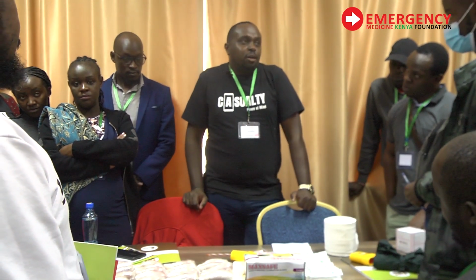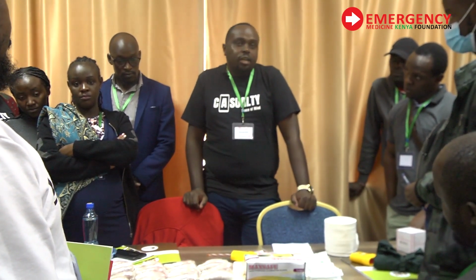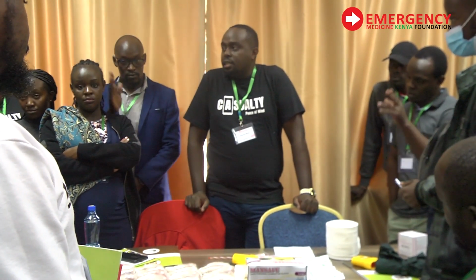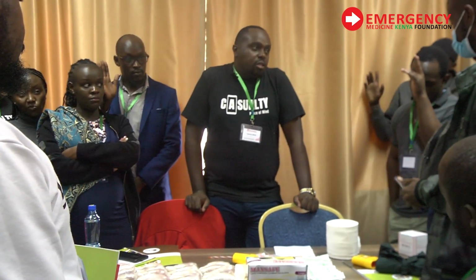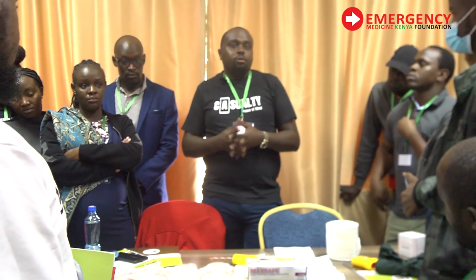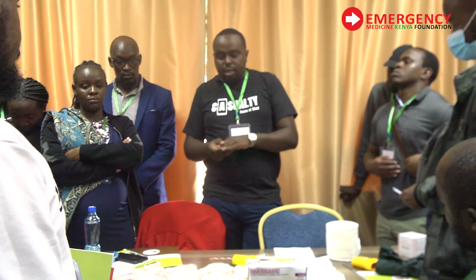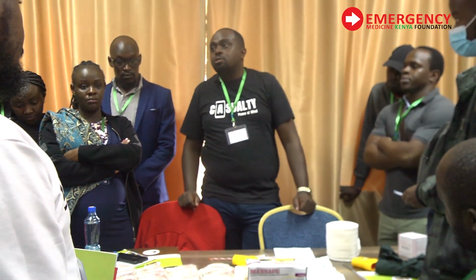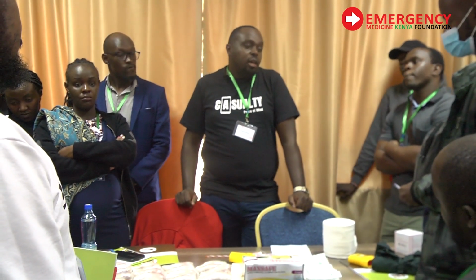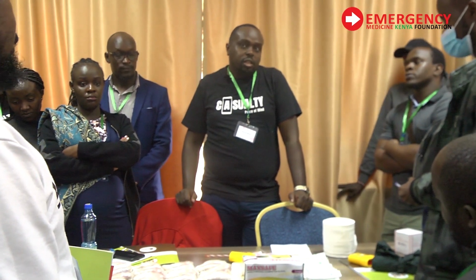So maybe I'll start with a question. How many of us have ever done an intraosseous access? By the show of hands. Yeah, so generally about 10% of everyone that is here. This is a quick skill that is life-saving and very important for all of us to know, because there comes a time when you are struggling to save the life of a patient and you're not able to get intravenous access, so the other option you have is intraosseous access.